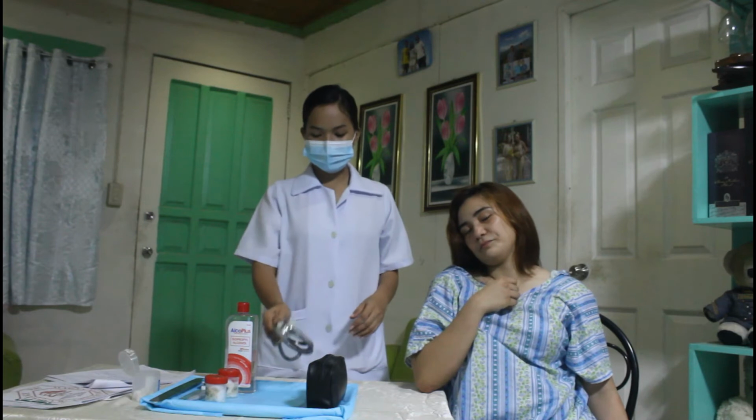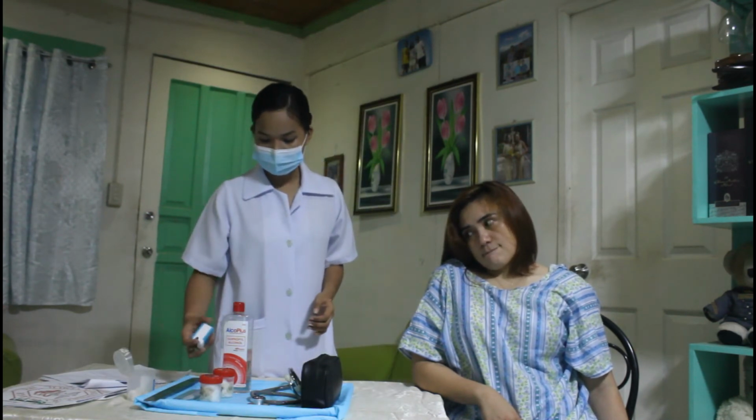So once we're done, then we will now get the oxygen saturation of our patient. So when using finger as monitoring site, we remove fingernail polish on one finger with acetone or polish remover. So this will ensure accurate readings, and also because nail polish may falsely alter saturation. So, I have here the pulse oximeter.